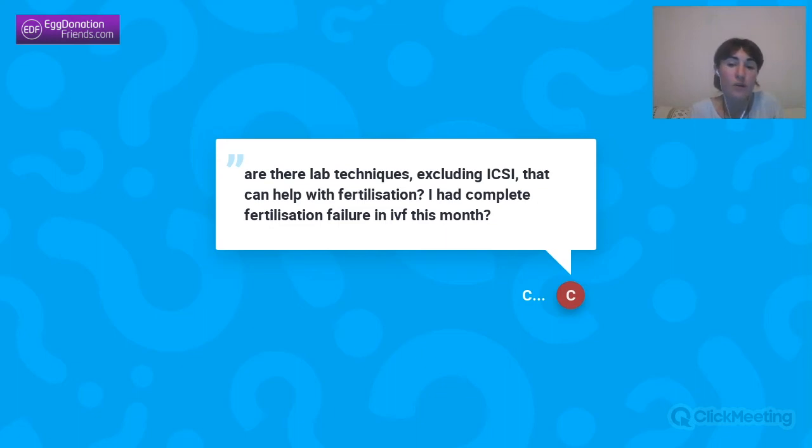We would need to know a little bit more about your case. So, for example, how the sperm sample is, because we've had some patients which had extremely bad sperm samples where nothing was moving. And I remember a patient in this situation when we retrieved sperm cells from the testicles through a testicular sperm extraction.